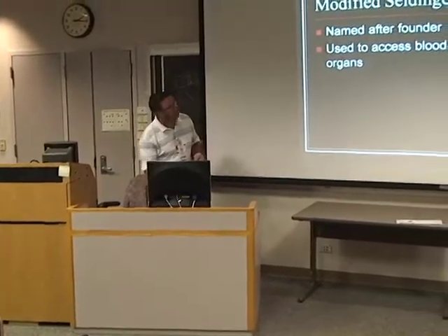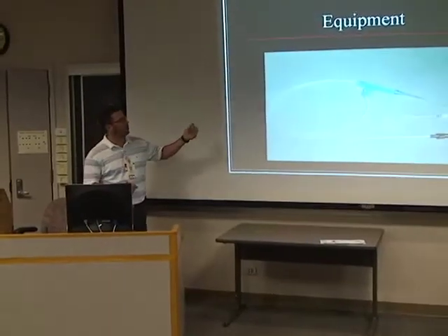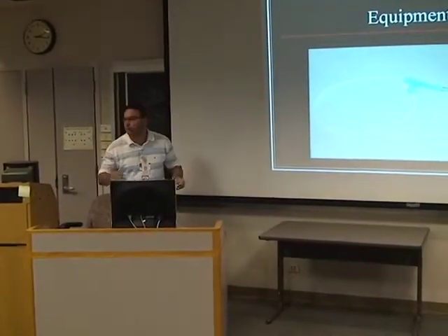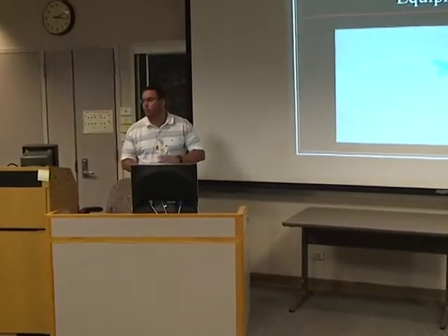All right. Let's see what else I got on here. So here's an actual picture of the equipment that we're going to use. It is very simple. The kit contains a needle, a wire, and an introducer sheath, and we'll talk about what order we do all this in, and we'll actually have hands-on with the equipment here.